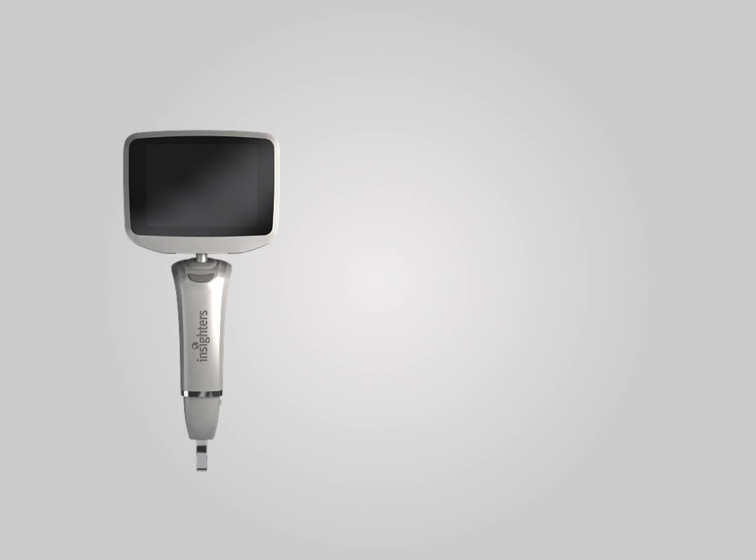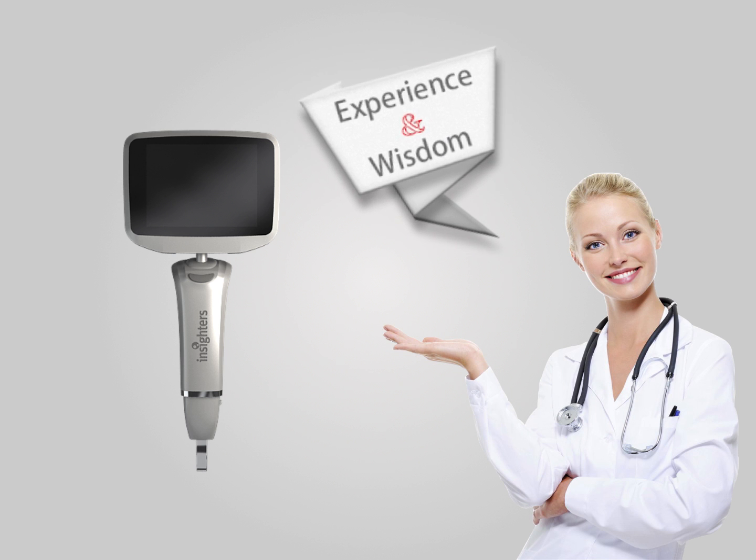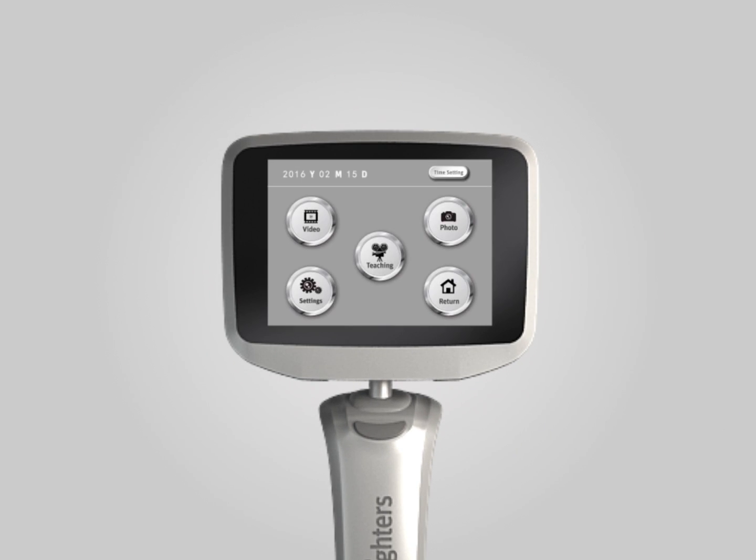IS-3 is a good helper, but what is more valuable is your experience and wisdom. Thus, IS-3 is equipped with a multimedia sharing feature, and you can easily record a case in picture and video for academic exchange, teaching, and sharing.